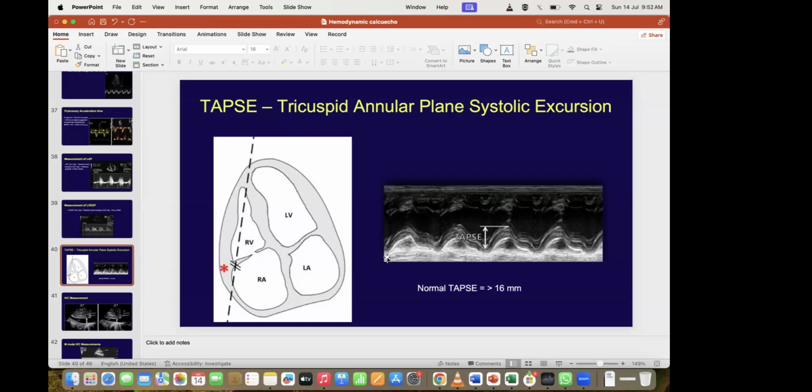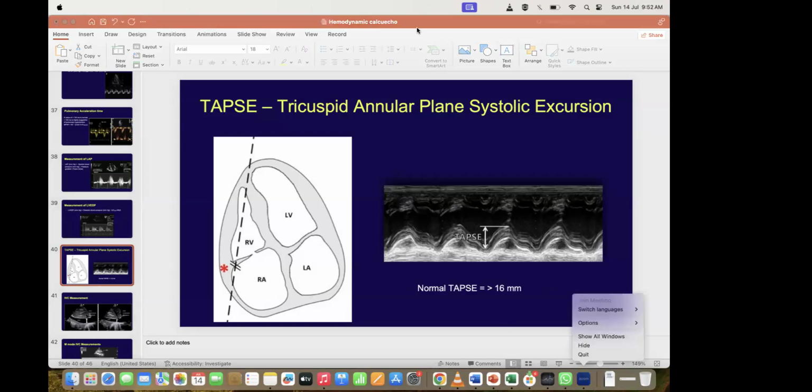And one more thing, it has an important role in monitoring ECMO patients, especially ECMO patients. So very effective. But trend is important. Only one. Yes, that is very important. And preferably only one person doing it. One machine, one person.